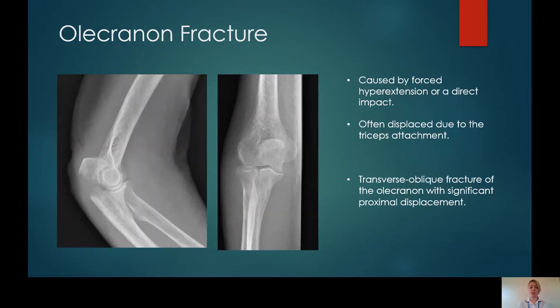Olecranon fractures are generally not so subtle and are caused by forced hyperextension or a direct impact. They can be very displaced due to the attachment of the triceps tendon. This is an example of a transverse oblique fracture of the olecranon, and again, you can't appreciate a posterior fat pad, although there is clearly an elbow fracture present.